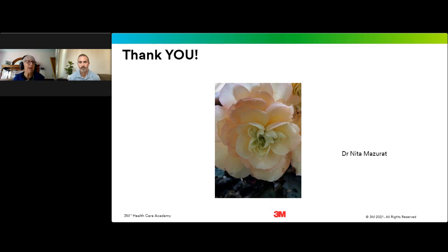As mentioned earlier, I think it was Lisa who commented about aluminum foil tests in ultrasonics. Also, washer disinfectors and automated washers need to be tested daily to make sure that they're working most efficiently. So we save bits of time by working smart, by working efficiently, by having our standard operating procedures. And what's your other choice? You have to do that. Functionality: you're wasting time if you're working with dull instruments. You're putting yourself and patients at risk if you're using dull instruments, for example. So functionality is part of this as well.